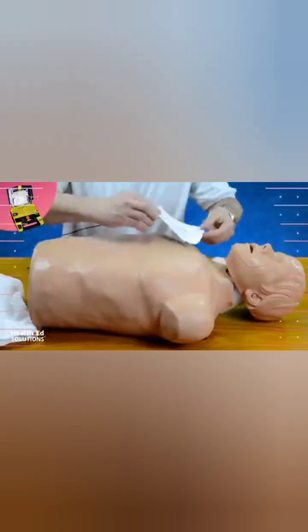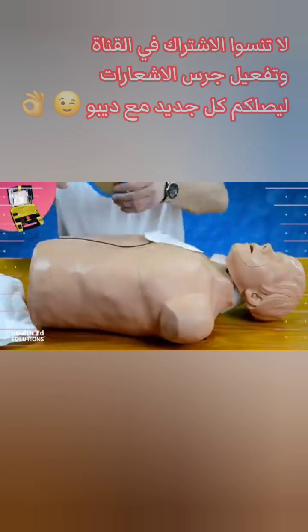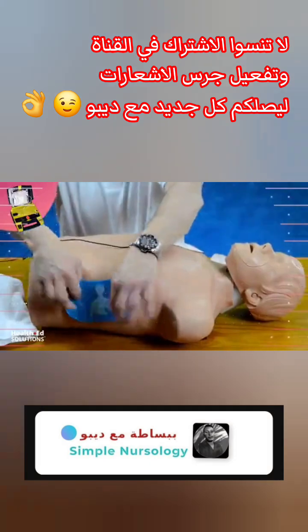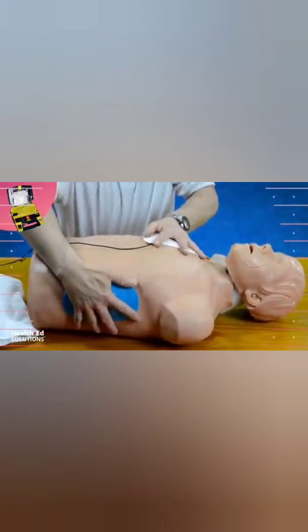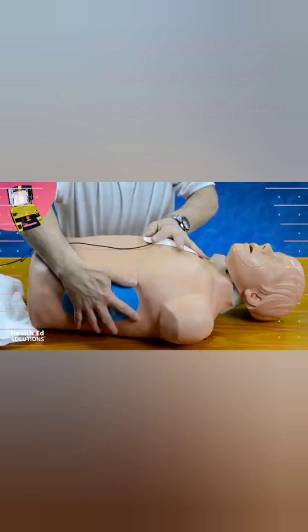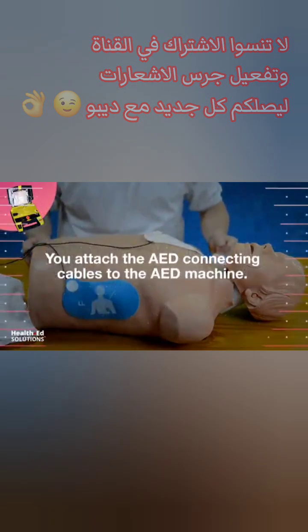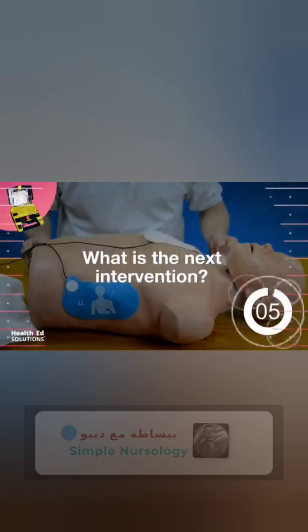You attach the adult pads to the patient's chest, placing one pad to the left of the nipple on the left side, about 2 inches below the left axilla, and one pad to the right of the sternum, just below the clavicle. You attach the AED connecting cables to the AED machine. What is the next intervention?